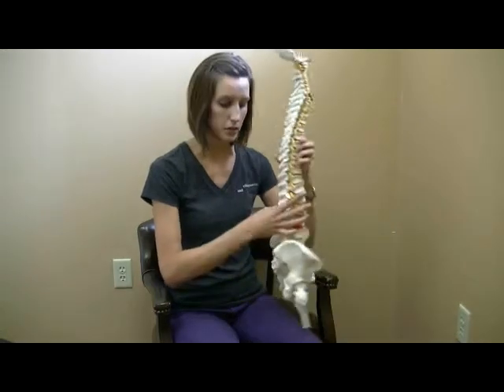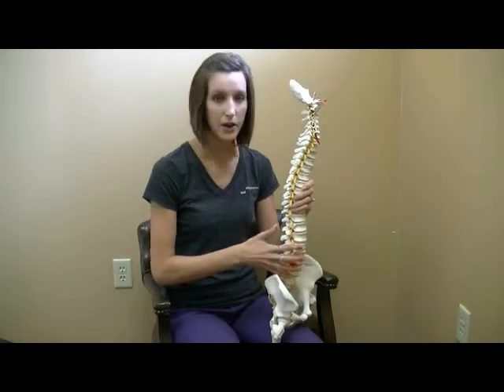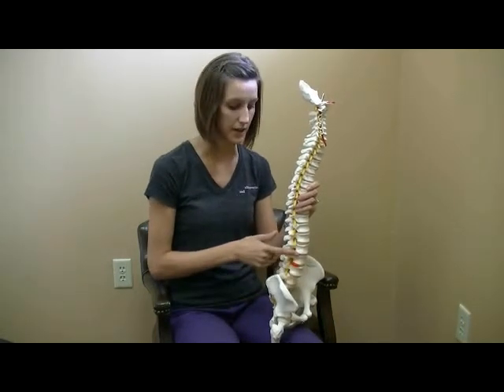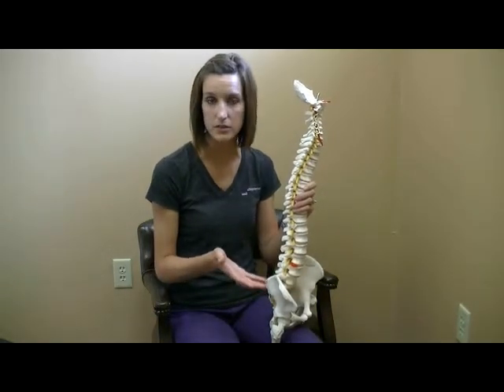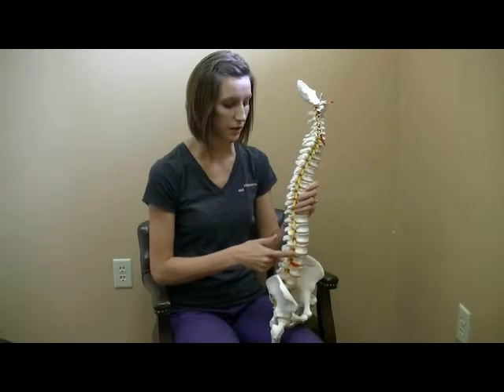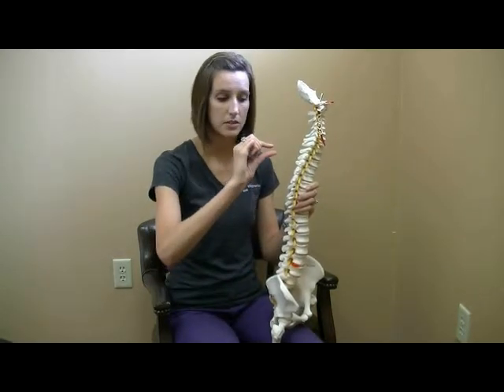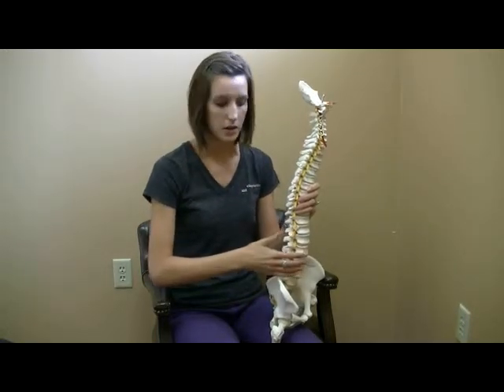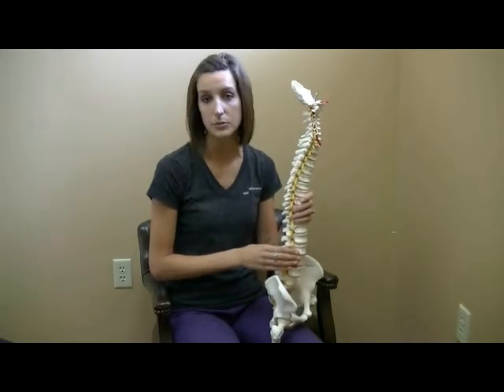And then a side view that we usually take to go hand in hand with that really shows you how healthy the lower back is, the lumbar spine. So you can tell from a side view if there is degenerative arthritis or osteoarthritis, they're the same thing, in the lumbar spine. And you can tell that because on an x-ray you usually see some loss of joint space. So that tells you that that disc is degenerative, you're starting to get some wear and tear of that joint, and that can correlate with symptoms.